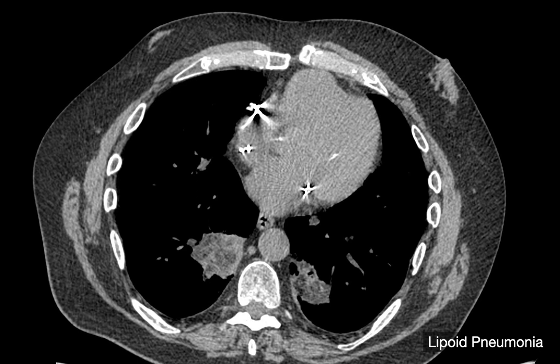Shouldn't confuse this for hamartoma, which are usually smaller nodules, not as aggressive and ugly appearing — usually just a well-circumscribed nodule in a sea of clean lung, as opposed to lipoid pneumonia where there's just a lot of evidence of chronic inflammation everywhere. Probably one of the entities that's clearly an unusual look we can usually be pretty specific about diagnosing without resorting to additional tests. Now, there are going to be cases where the lipoid pneumonia is lipid poor, in which case you will work it up as a nonspecific mass. The lipid can be introduced exogenously or occasionally endogenously — in those endogenous cases, usually there's some sort of airway occlusion where goblet cells secrete lipid-heavy material that incites the lipoid pneumonia.